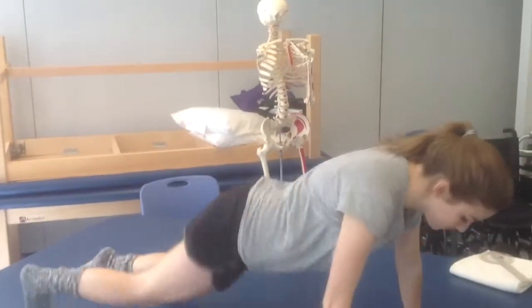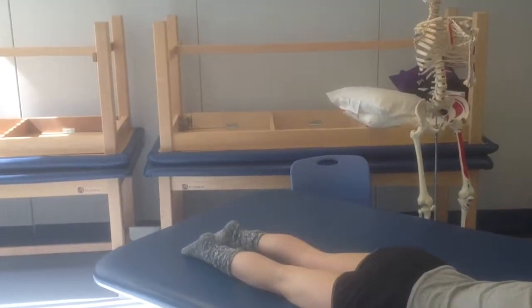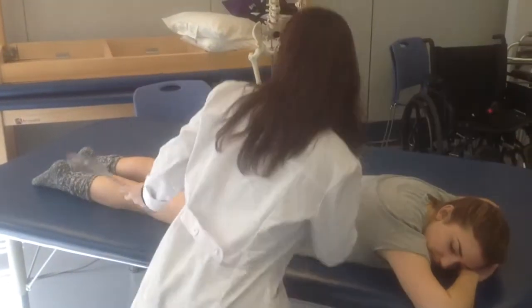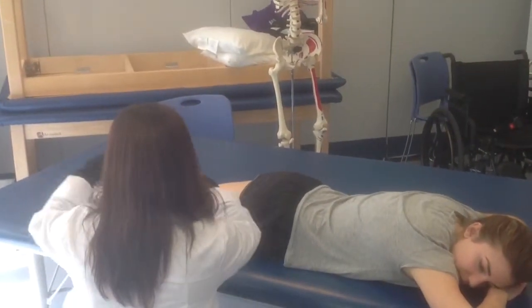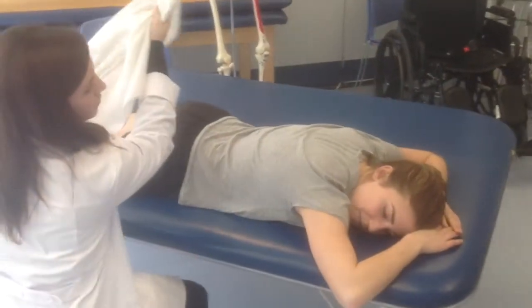Place the subject in the prone position, with both knees extended and the hip to be tested in zero degrees of abduction, adduction, and rotation. A pillow may be placed under the abdomen for comfort, but no pillow should be placed under the head. Would you like a pillow under your stomach, Ms. Corbin? I'm okay.